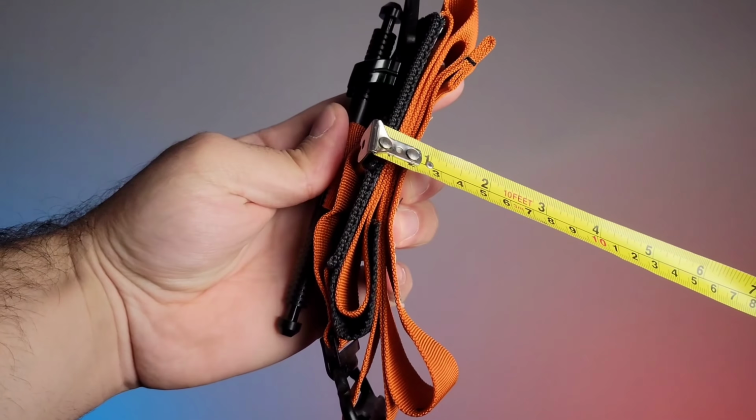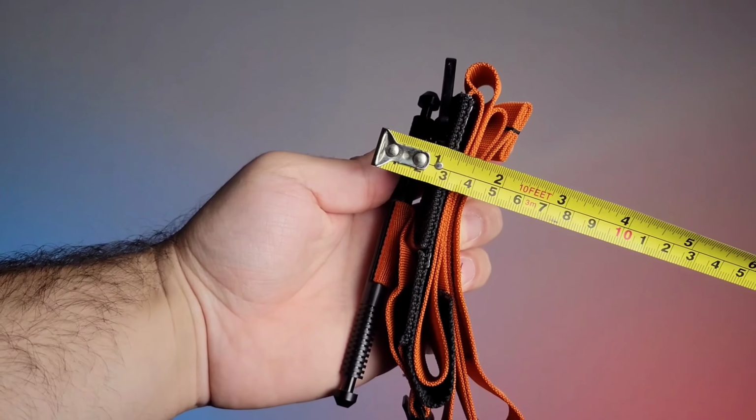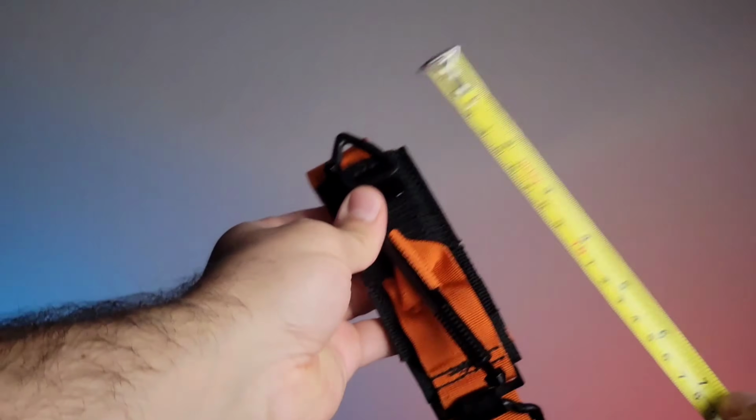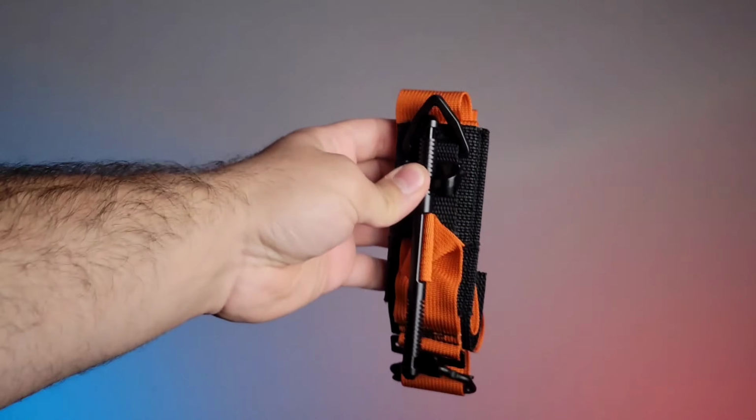Now, the idea is that everyday carry, although it should be something that I think we spoke about this expression before, comforting, not necessarily comfortable. If it's not comfortable at all, it usually means that a person will ultimately not carry it. You do want to find an option that you would carry every single day, because if it's not comfortable, you'll often just decide, I'd rather not do it right now. It's not as important to me. So this continues the line of options of what would be able to be carried while not sacrificing functionality for what a tourniquet is supposed to be.